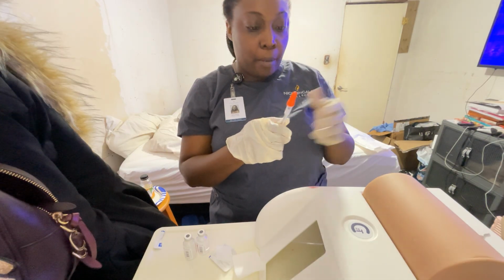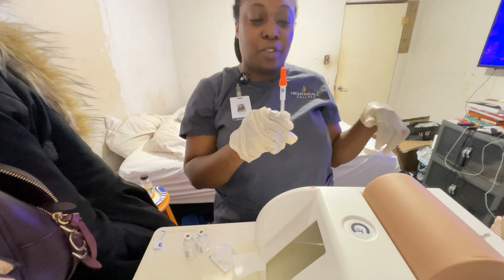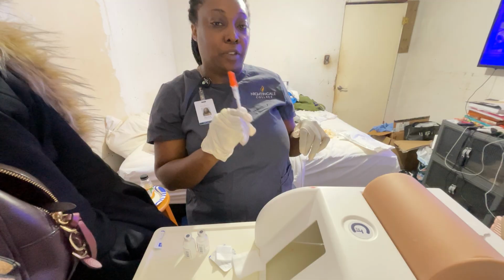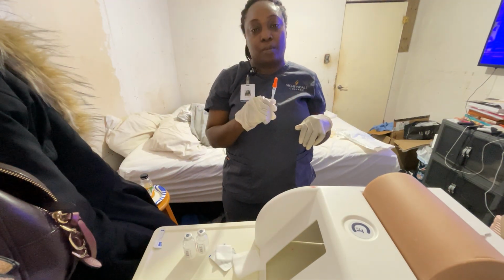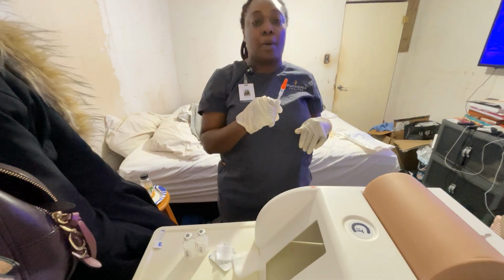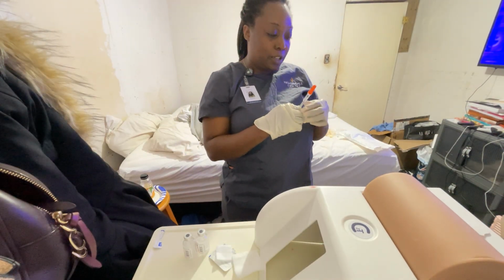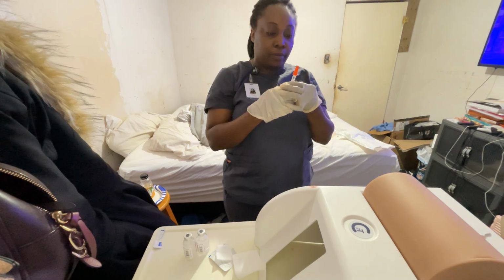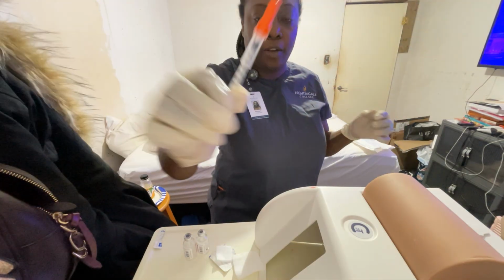I'm also going to have my nurse Stacy with me, or another nurse with me, to verify that I am drawing up the correct amount of insulin, because I know that overdosing or underdosing can be fatal to the patient. So this is why we always have 2 nurses when administering insulin. So I have 4 units of air. You can verify with me as well. This is 4 units of air.